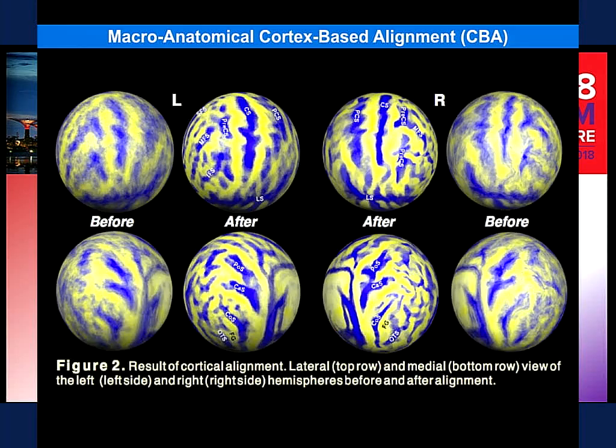And here's an example of how this technically works. I will not go into details, but the idea is that the cortical folding, the curvature calculation, is brought onto a spherical representation. You see that this curvature information, like this is the central sulcus, is in the superior frontal and so on. Although it's curvature which is shown here, you see the macroanatomical information, because the curvature is quite similar across brains, not perfectly the same. Therefore, we slightly smooth the curvature as well.